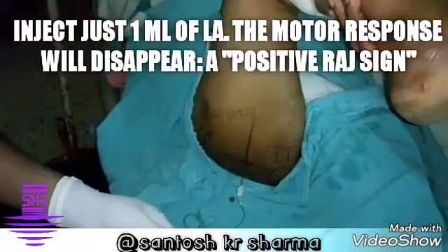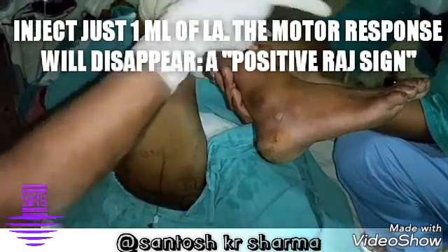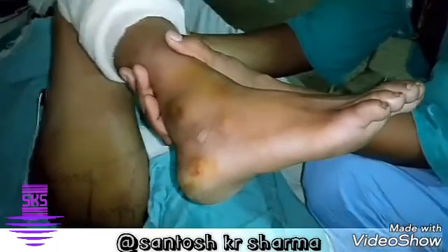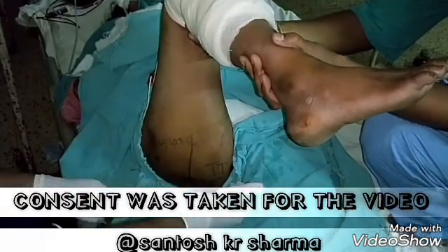Now let's see what happens on injecting the drug. The advantage of the lithotomy approach is that the patient will not have to be turned. So if the patient is in pain, or for some reason you cannot convert the patient into the lateral or prone position, this approach may be used. This is one of the approaches which we can use for giving a transgluteal sciatic nerve block.